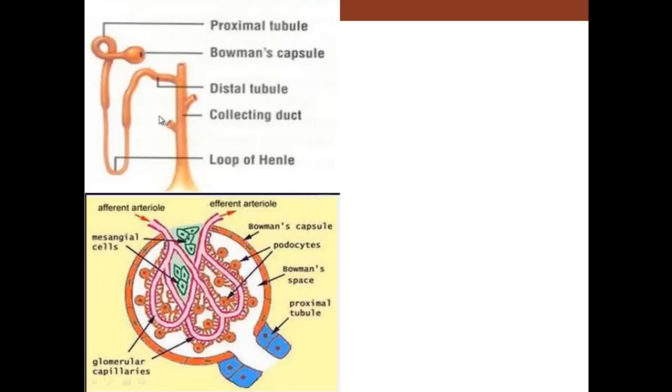And here, if we can see the glomerulus more easily, this is the corpuscle right in through there, and you see you have an afferent going in and efferent going out. You have some extra cells, some mesangial cells that are located in through there, and then you have endothelial cells lining the blood vessel, of course, and then you have the glomerular capillaries, as you see, which are the blood vessels. Then you have the podocytes. The podocytes are the cells through which the fluid goes after it gets out of the blood vessel to go into Bowman's space, and then from Bowman's space it goes out the proximal tubule.